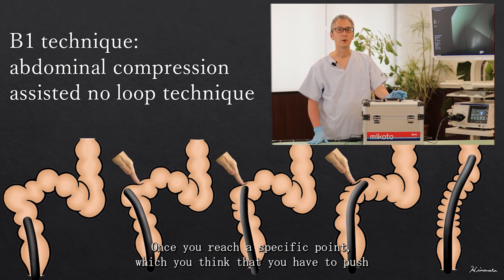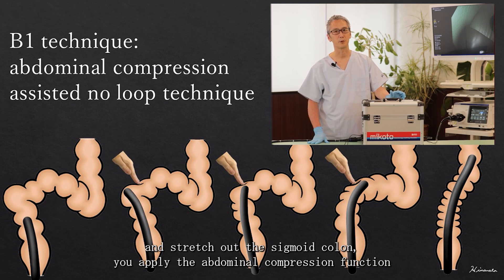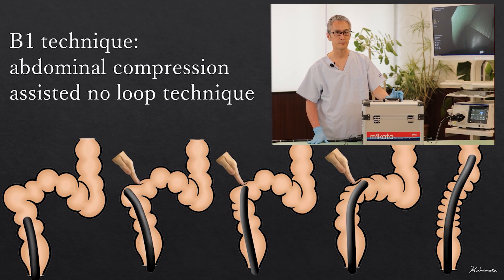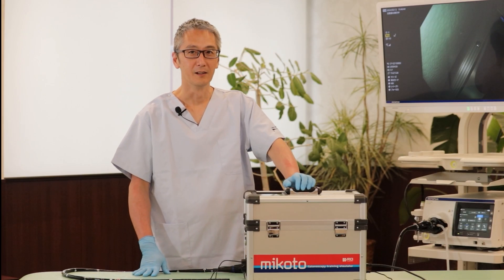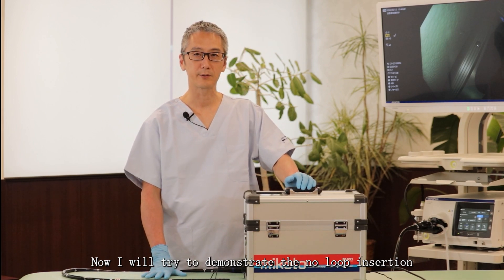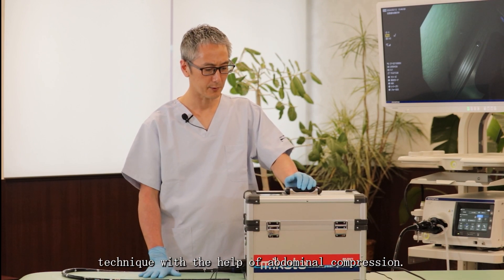Once you reach the specific point where you think you have to push or stretch out the sigmoid colon, you apply the abdominal compression function to help you pass through the sigmoid colon without stretching it out. Now I will demonstrate the no loop insertion technique with the help of abdominal compression.